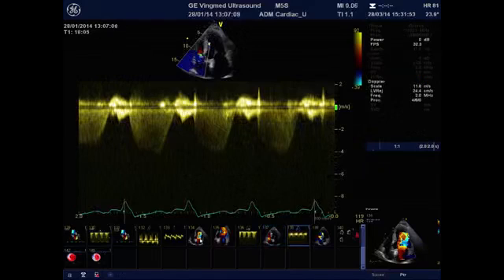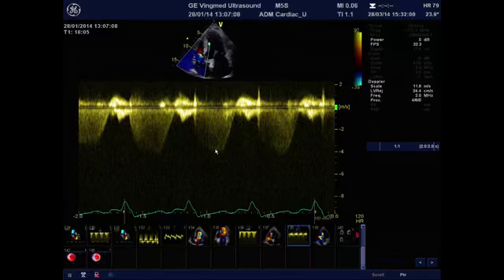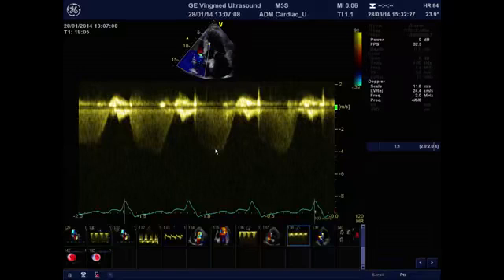which was accompanied by the development of significant pulmonary hypertension. And so if we look, there is nearly 4 meters per second, so the transtricuspid pressure gradient is approximately 50-55 millimeter of mercury. We have to add the right atrial pressure, which is indeed difficult to assess during exercise by the measurement of the inferior vena cava diameter. So usually we add 10 millimeter of mercury, and the patient has developed significant pulmonary hypertension with a systolic pulmonary arterial pressure estimated at approximately 60 millimeters of mercury.